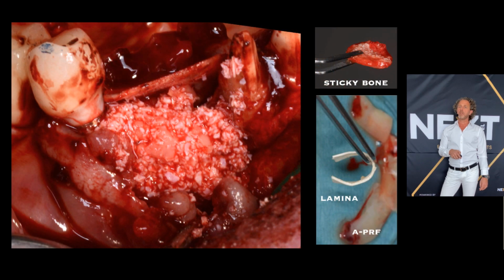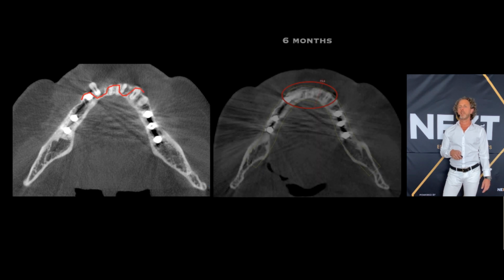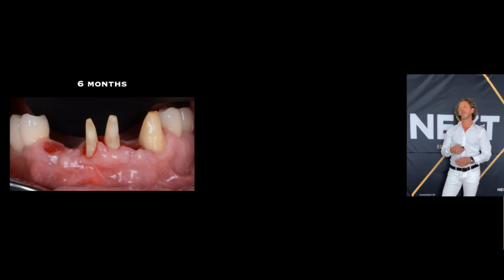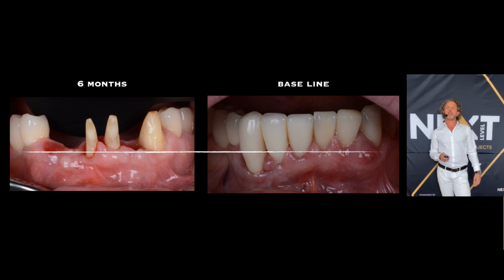So I utilized the GBR, it's sticky bone covered with the lamina and PRF. And this is how we started on the CBCT. And this is how we ended up after 6 months utilizing the GBR. So I would say now the site is ready for implant placement. And look at how much tissue we gained by utilizing the GBR.